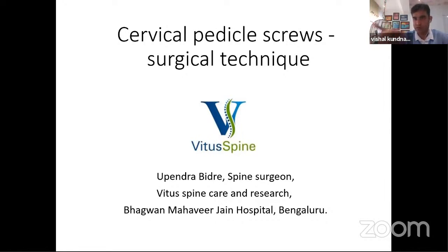Because the chances of dorsal burst out, the dorsal surface of the lateral mass bursting while a screw goes in, is there. So if you go with your drill in full speed, then likely you won't wobble out. And if you're in a good trajectory, you don't need to change your trajectory. So that's what I feel. And the chances that you will burst out are less.